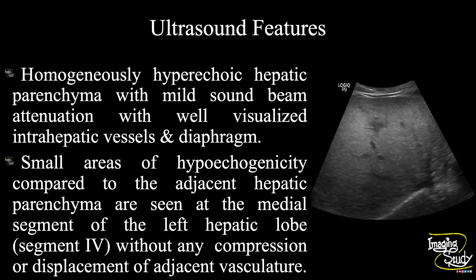In summary, hepatic parenchymal echogenicity is homogeneously increased with mild sound attenuation, with well-visualized intrahepatic vessels and diaphragm. Small areas of hypoechogenicity compared to the adjacent echogenic hepatic parenchyma are seen at the medial segment of the left hepatic lobe, known as segment 4, without any compression or displacement of the adjacent vasculature. This feature is suggestive of focal fat sparing.